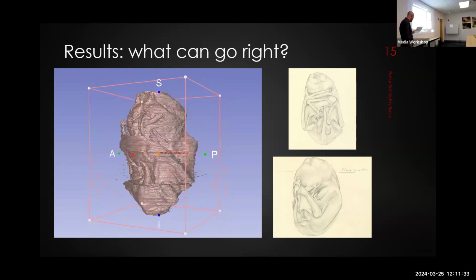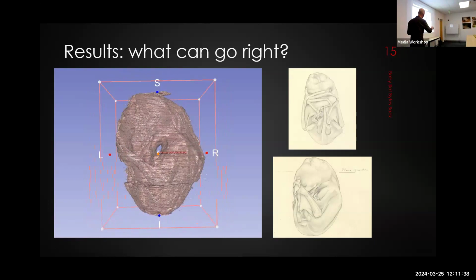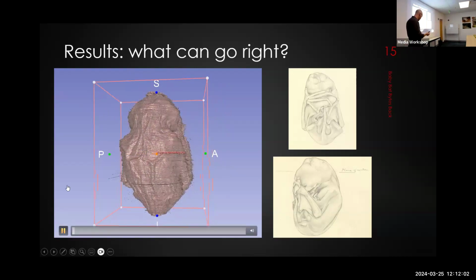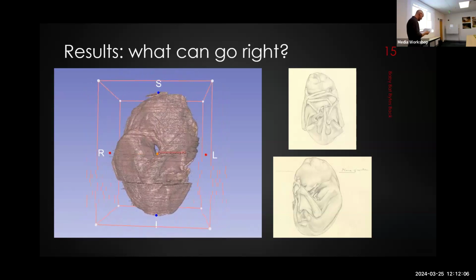The original line drawings, these guys on the right, and especially the slide label metadata provided a helpful reference for the slice interval. That is how far apart the slice images should be placed, and thus how pudgy or stretched out the bat embryo should be. And then from here, the stack can be cross-sectioned in any arbitrary plane. It can be measured internally and externally, cleaned up and smoothed for 3D printing, all of that stuff.